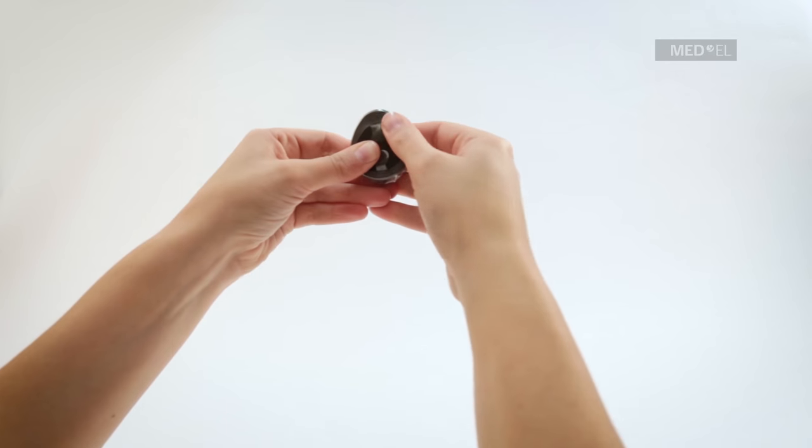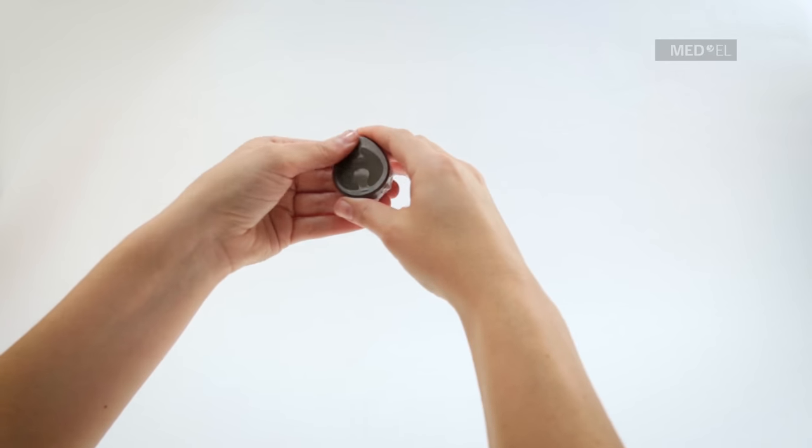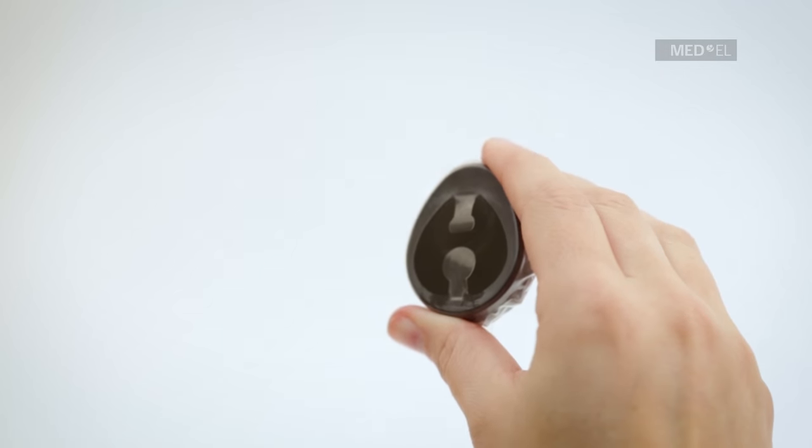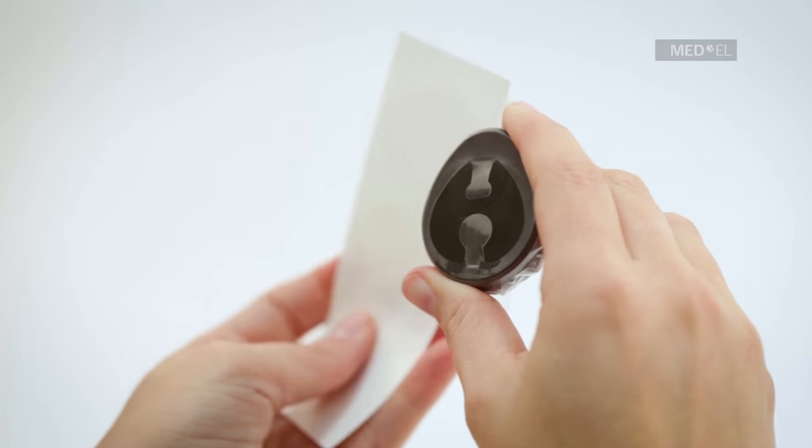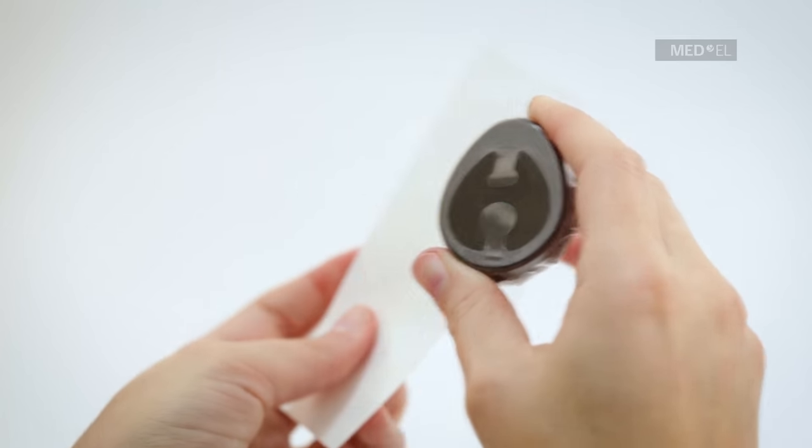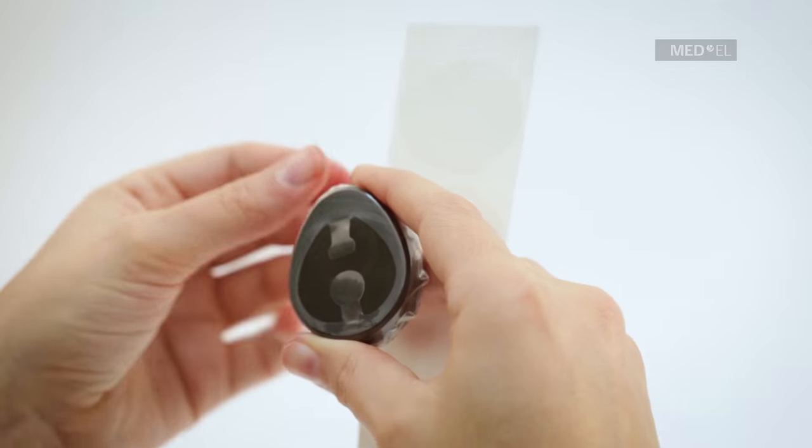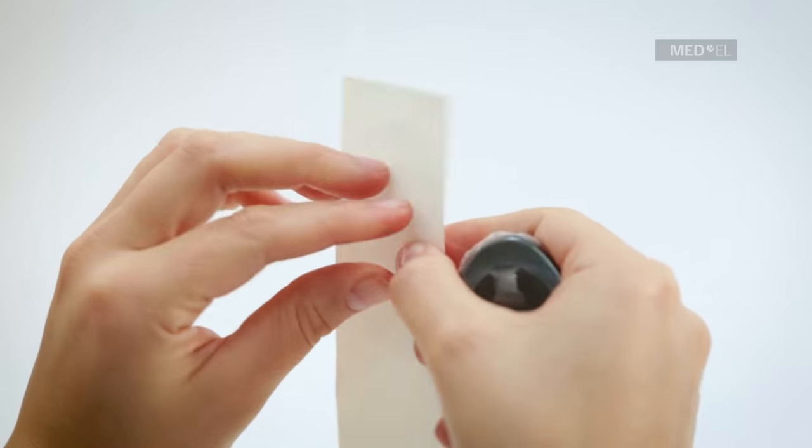The included adhesive strips are used to cover this opening. Before attaching the adhesive strip, make sure that the strip and the surface of your Rondo and the waterware are clean and dry. Remove the adhesive strip from the protective cardboard.